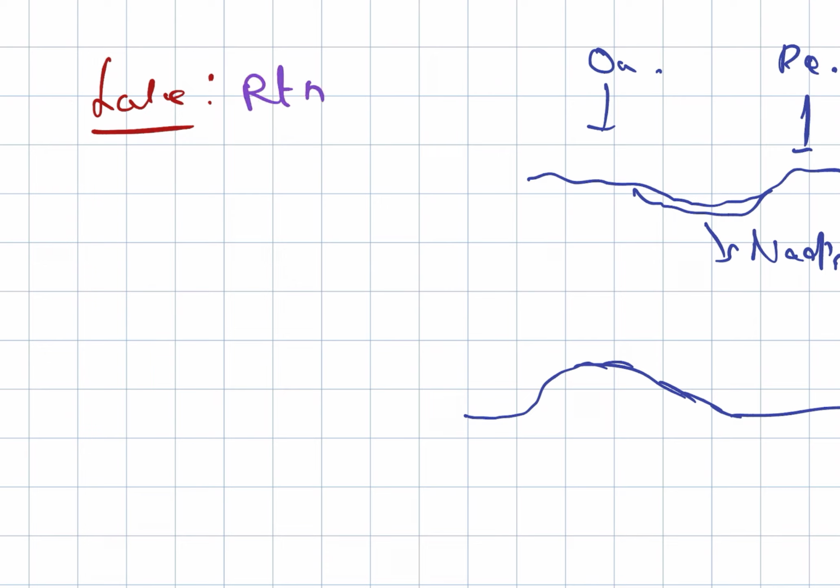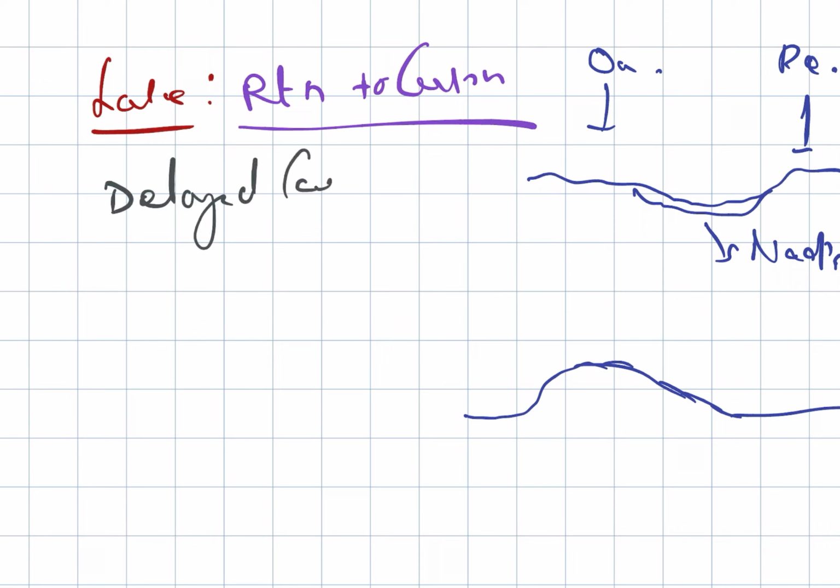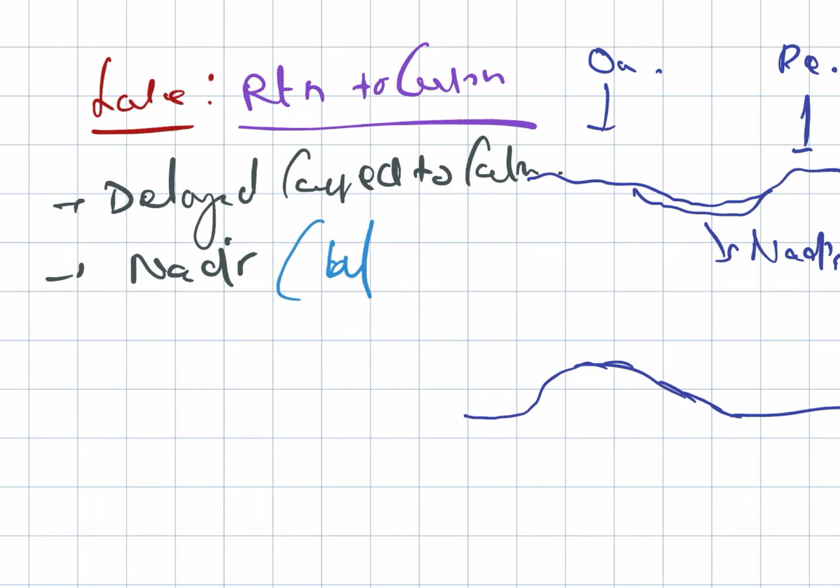Now looking at the relationship to the contraction, here it's delayed compared to the contraction. The nadir of deceleration occurs after the peak of contraction.